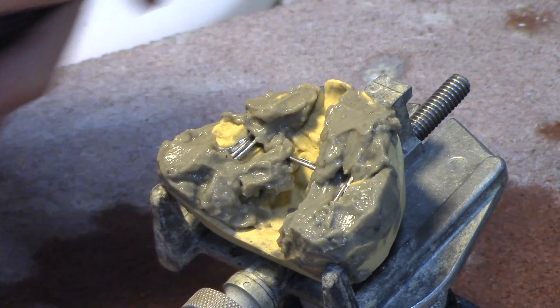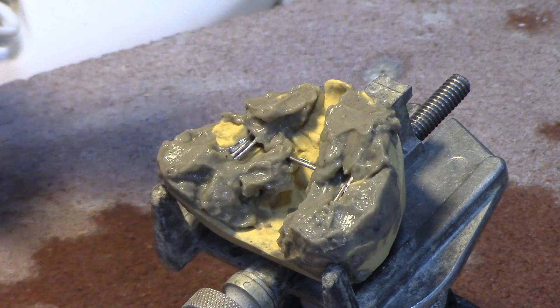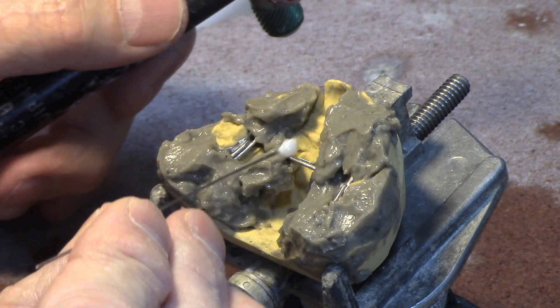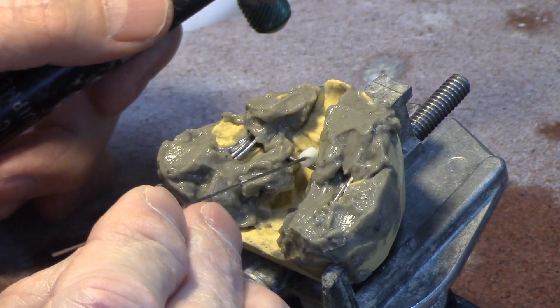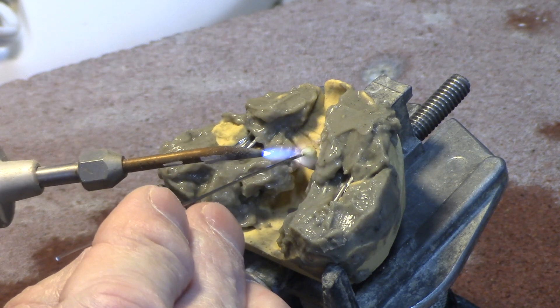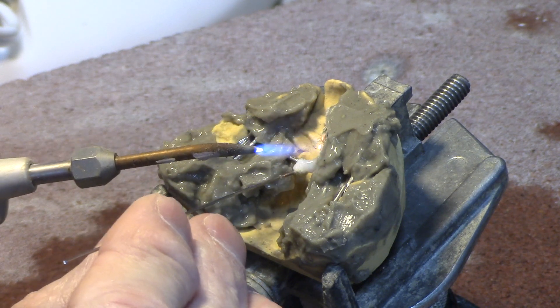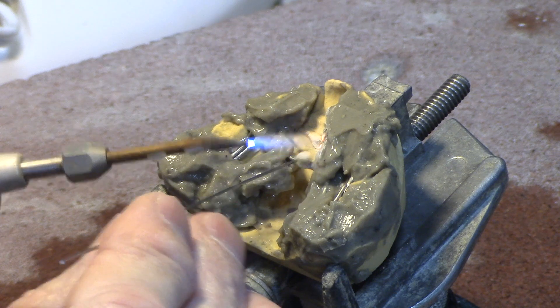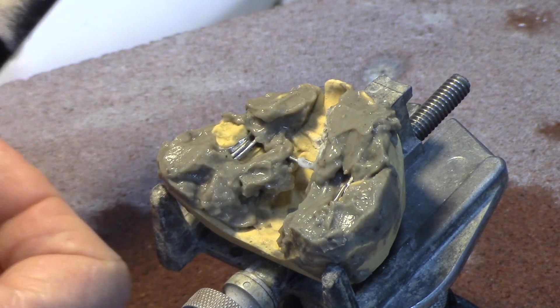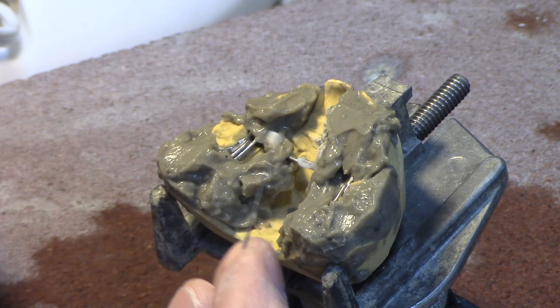Now I've got my little propane torch right here. I've got the flame adjusted and I'm going to use this probe, dip it in the flux, and transfer the flux over to it. I'm going to heat it a little bit so it'll kind of run around. I'm going to turn my fan on so I can move the gases away from me, so you'll probably hear that.